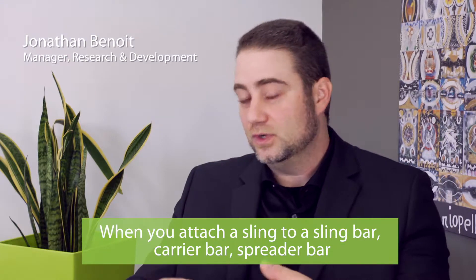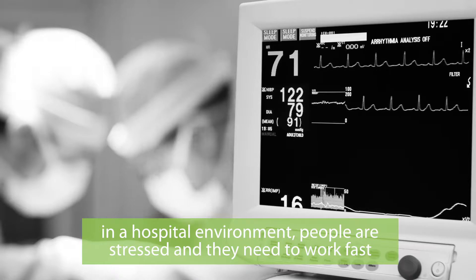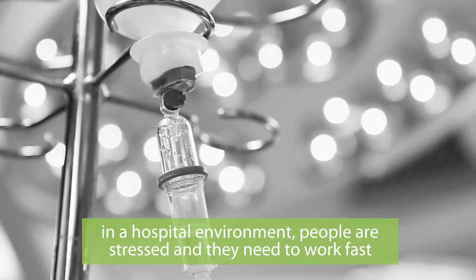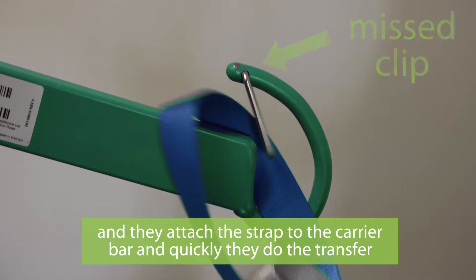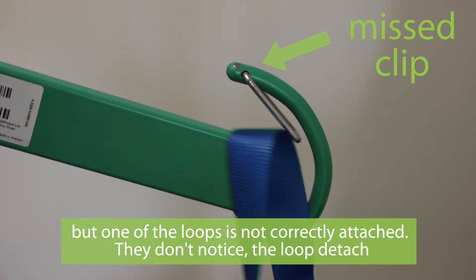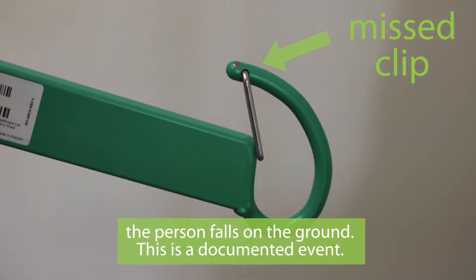When you attach a sling to a sling bar, carry bar, or spreader bar, in a hospital environment people are stressed and they need to work fast. They attach the strap to the carry bar quickly and do the transfer, but one of the loops is not correctly attached. They don't notice, the loop detaches, and the person falls on the ground. This is a documented event.